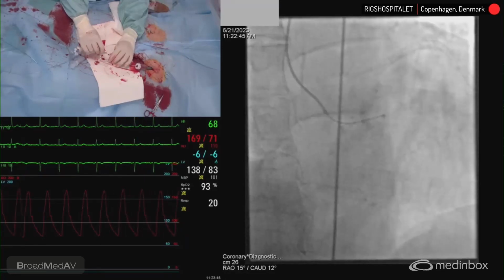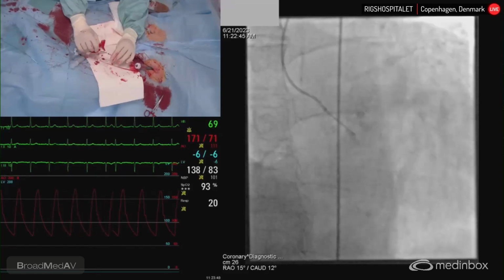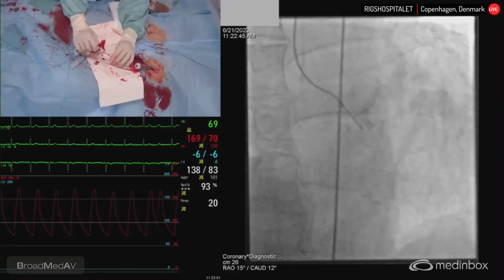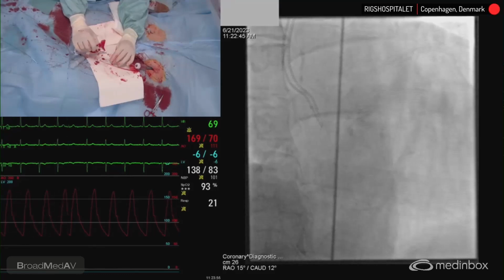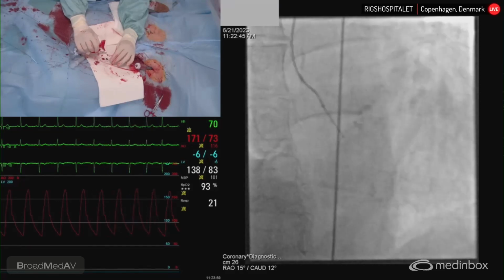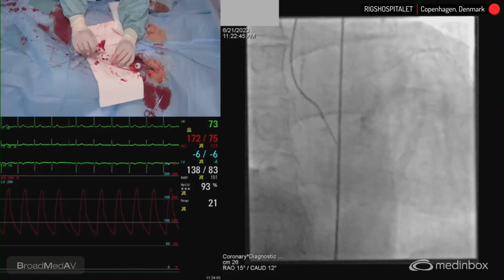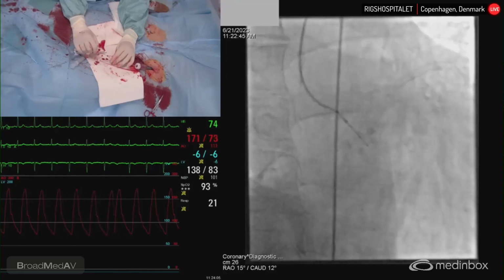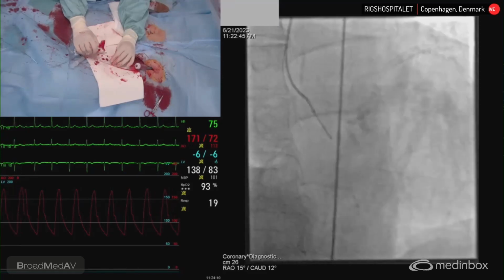Yeah, or you're very close. Probably not, but it's in that neighborhood. Or it's just below it, actually. It's even lower. You see that thing opening there, the cap. Yeah, and that's not the way the jet is, you know. Maybe we need a nail to.